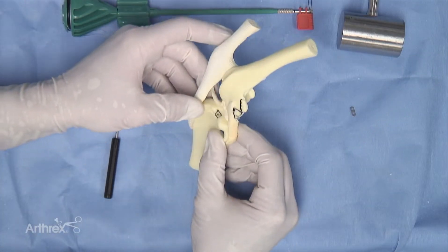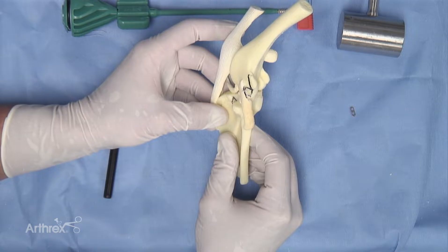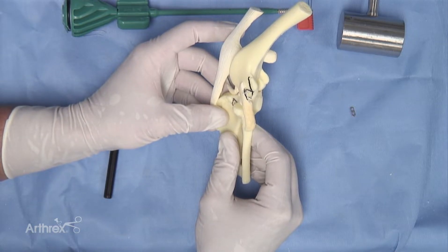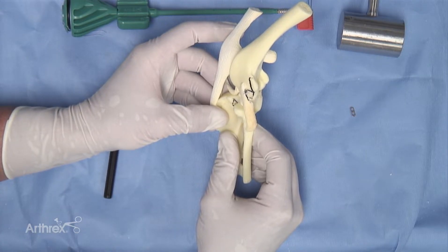Another option when performing a swivel lock type procedure is to use the swivel lock as a base anchor and then use a tensioner in order to produce the required tension so that you are happy clinically with the stifle stability.